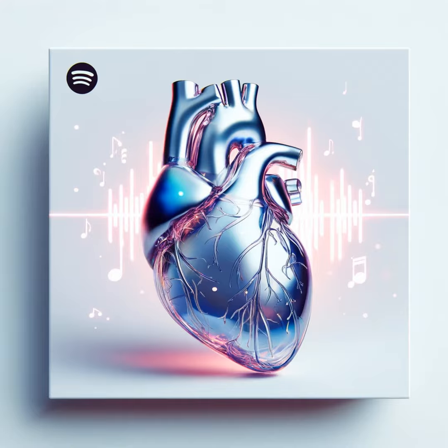7 is mode switch episodes. You can either say something like none or a specific number like 3 or 4 or 5, or if it's happening a lot, you can say frequent. 8 is tachycardia events. 9 is sensing threshold settings. It should be less than 50% of sensing capability. And 10 is pacing output. You want this set at twice the threshold voltage and 3 times the threshold pulse duration.